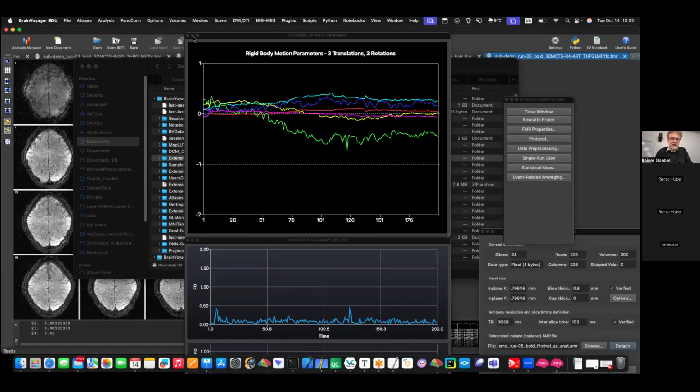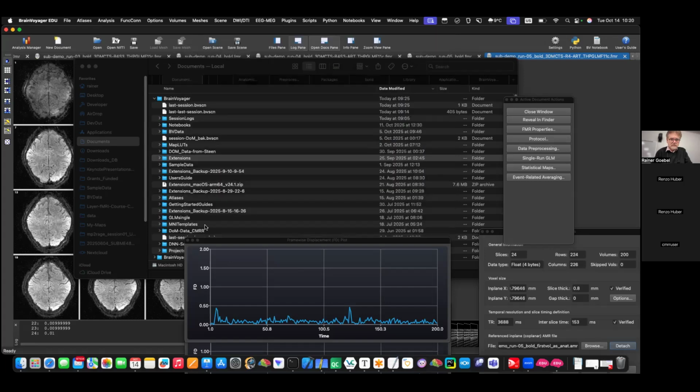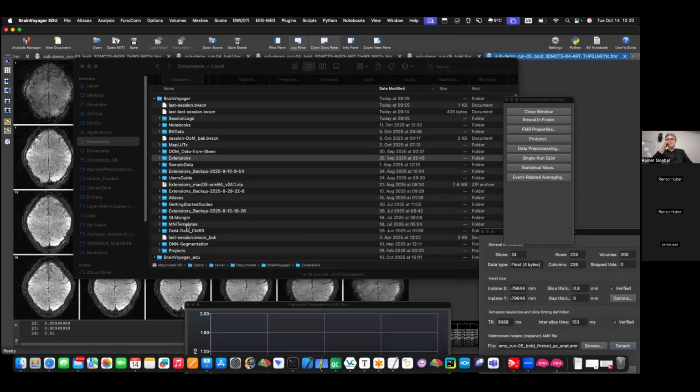So that was run 5. One more to go. Again, this can be scripted, except that the new commands using this transformation file have to be added in the Python. I will do this before release. So you can script all that, right?